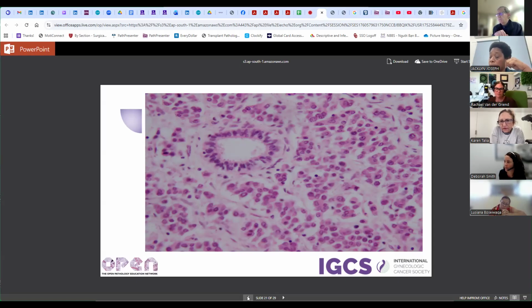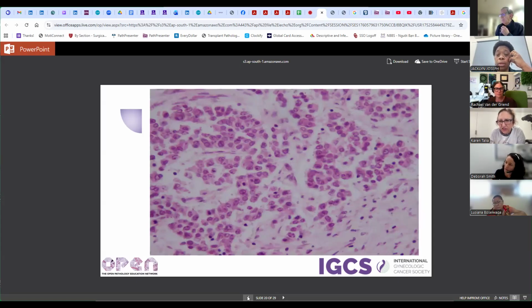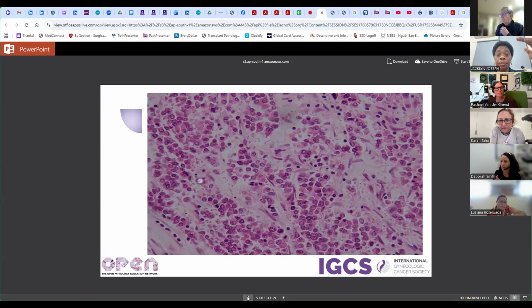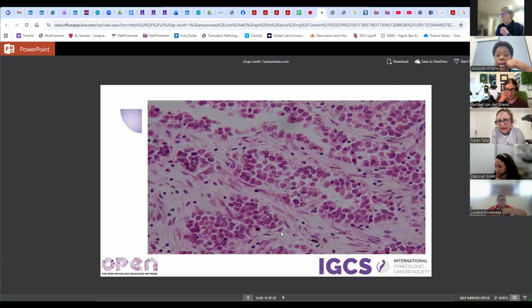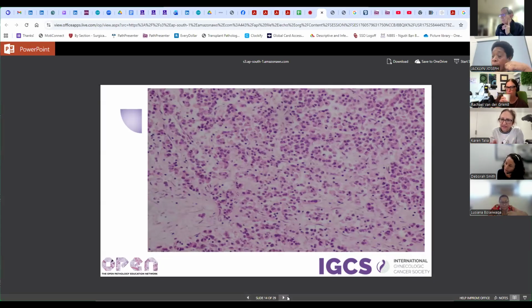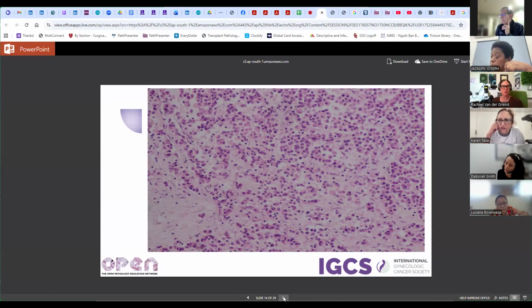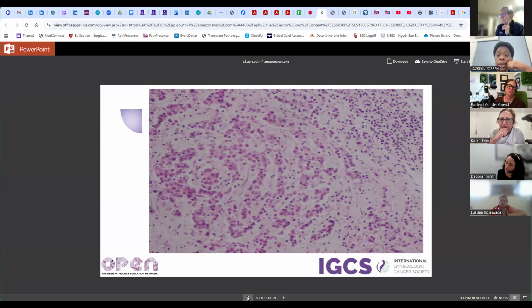There was one other morphologic point I was going to raise. Jacqueline, you mentioned some gland formation. Further up, you keep going further up. It was a couple of the earlier ones, this sort of appearance. I'm querying whether they're truly glands or whether we've just got some discohesion in masses or nests of cells that's creating a pseudoglandular appearance. I think that's a distinction worth interrogating, going to higher power to see if you can actually see a luminal layer of cells that are columnar or cuboidal and truly a glandular epithelial layer, or whether the cells all have the same morphology and they're just discohesive and falling apart a bit centrally. I think in this case it's probably the latter. I don't know that they're truly glands.